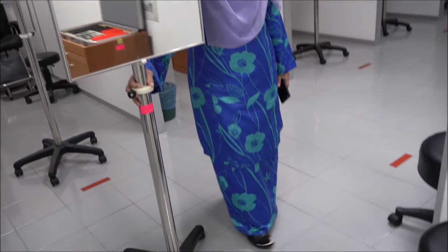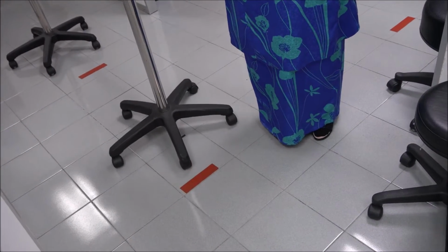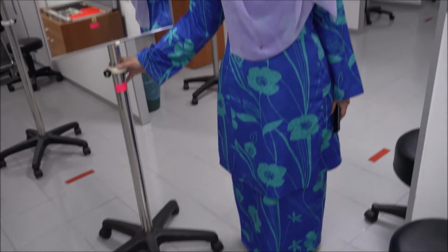Ensure that the mirror is at a 3-meter distance in front of the patient or subject, and refer to the red tape on the floor. This is a 3-meter marking in front of the subject. Ask the subject to remove her glasses or contact lenses before measurements are taken.